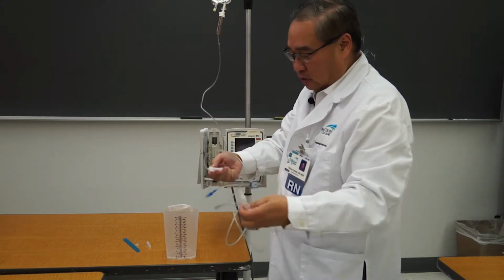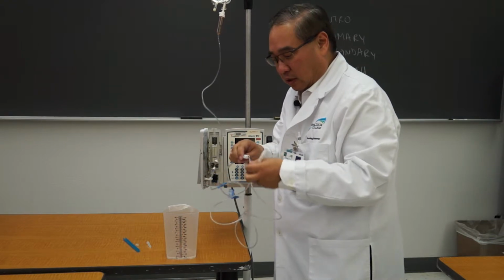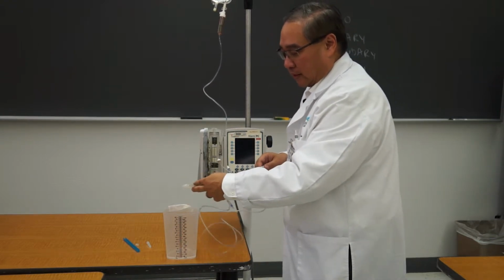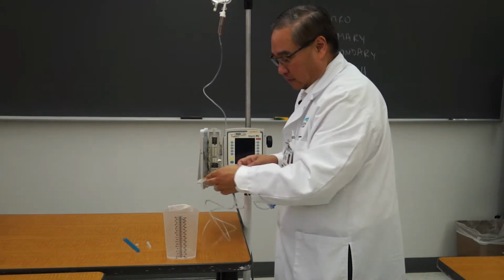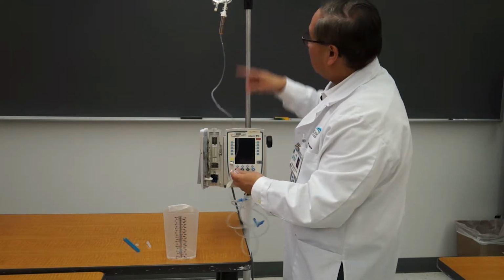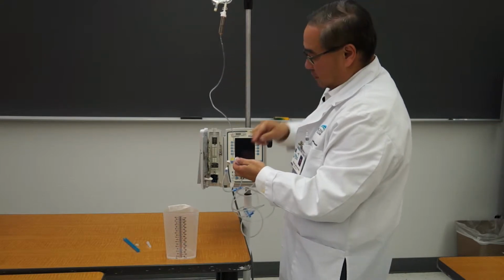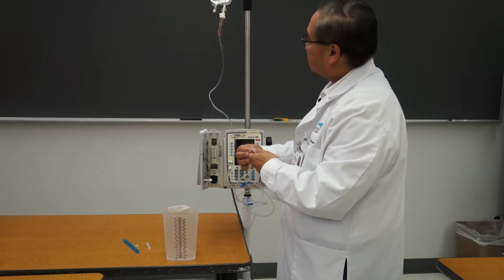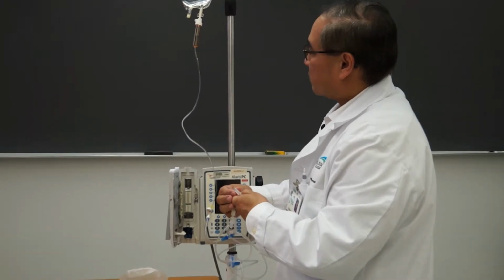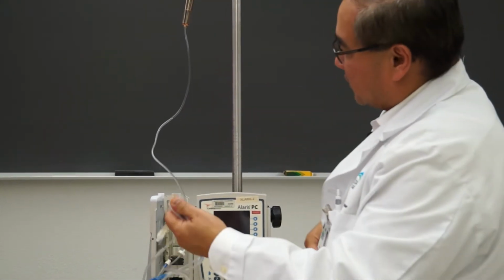Okay, in this case, I have the fluid here. What I'm going to do here is I'm going to use a roller clamp again. I'm going to open up slowly while holding this over somewhere where I can get the excess fluid. And you'll notice that when I open this up, you're going to see the bubbles move. Okay, so I'm going to open up slowly. See, the bubbles are moving. It's going down the line. I can stop it at any time by using the roller clamp.